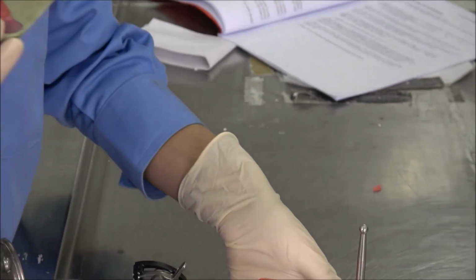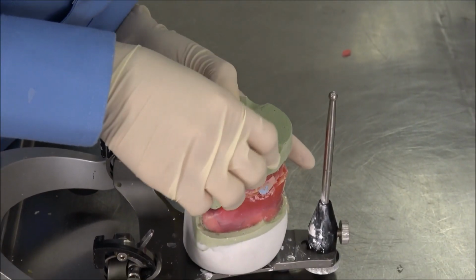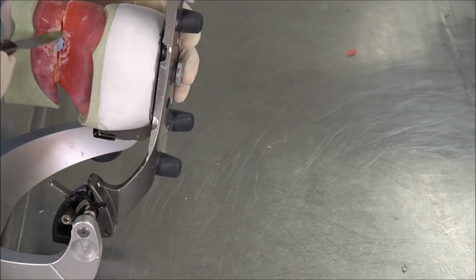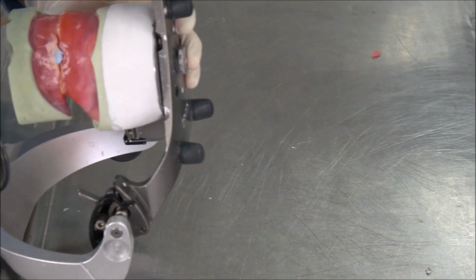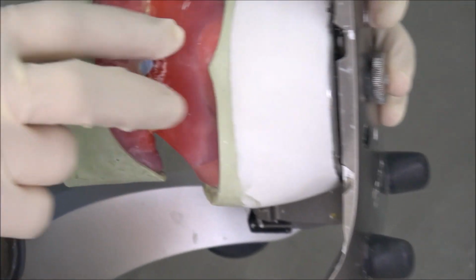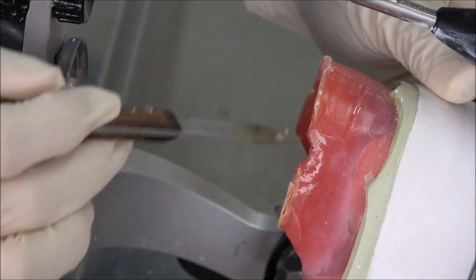Only then do we seal our upper and lower models. Okay, so we just fix it. Make sure there is nothing in between. Can you see here? There is a big gap here. Why is there a gap? We missed out something. We have to remove our excess here.